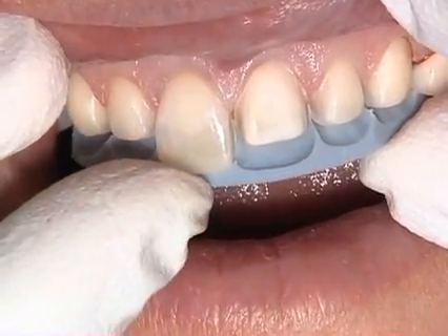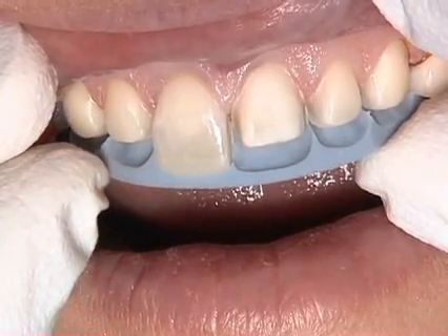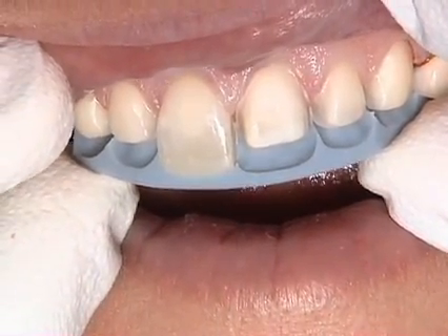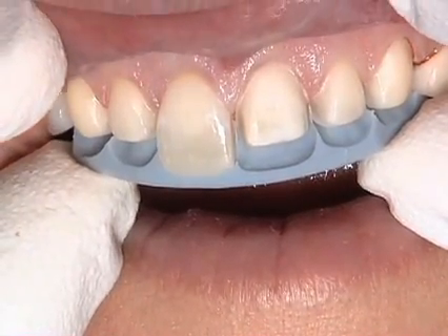Our primary goal was to take the composite off, and that was really dictating where the finish line finished. We would like two to maybe two and a half millimeters of reduction off the incisal edge.